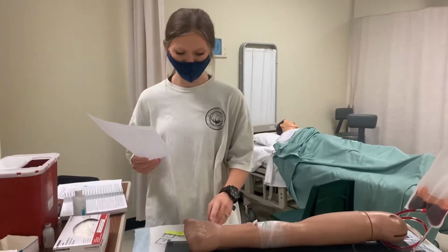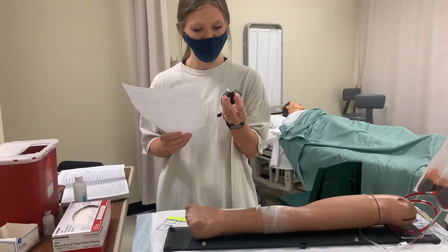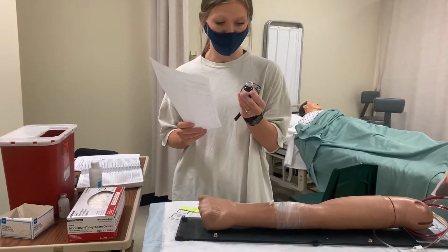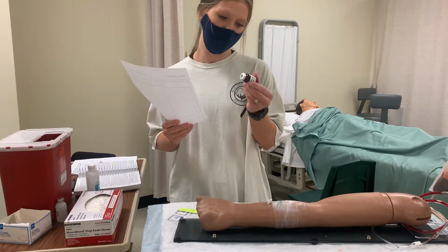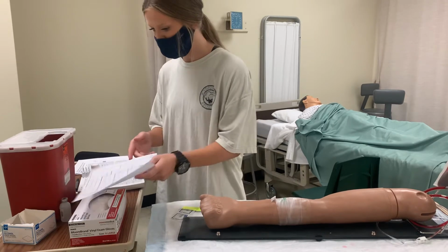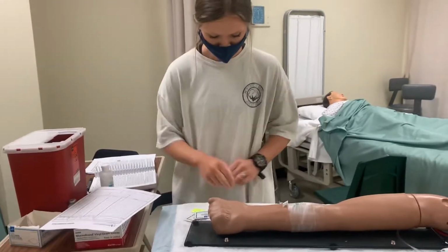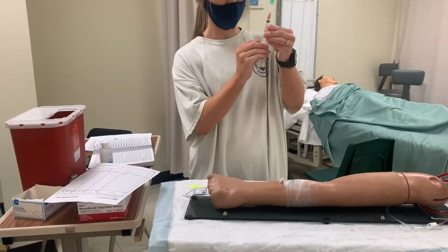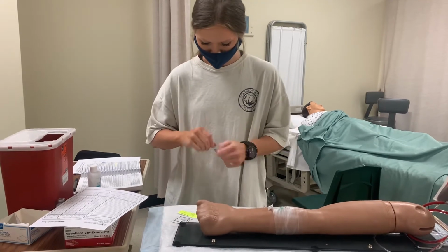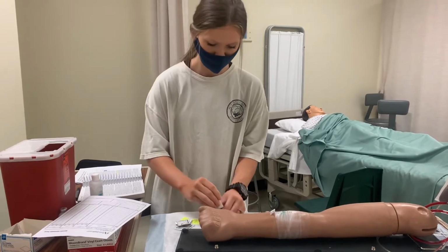I'm going to take my MAR and compare it to my vial, which is furosemide, 10 milligrams per milliliter. So it matches my MAR, and I'm going to draw up 2 milliliters. Let me check the expiration date. It expires June of 2021, so we are good with that. Now I'm going to get ready to draw it up. Alright, so I have my 2 milliliters of air. I'm going to clean the top for 30 seconds.